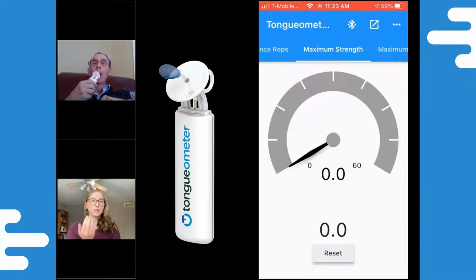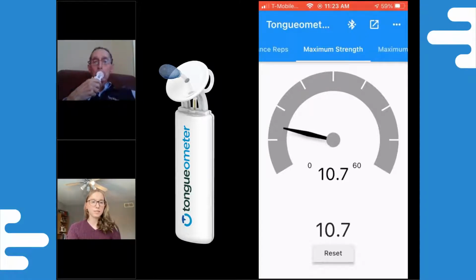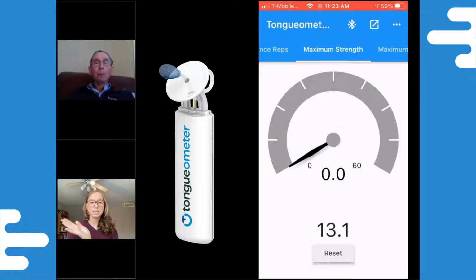So the bulb is placed close to the lip guard. He places the bulb in his mouth and then presses up against the roof of his mouth using only his tongue. The application measures his tongue strength in kilopascals, so that's how much pressure he's applying to the bulb and pressing it against the roof of his mouth. So as you can see here, his maximum was 13.1 kilopascals. The application shows up to 60 kilopascals. The device itself is able to measure up to 100 kilopascals.